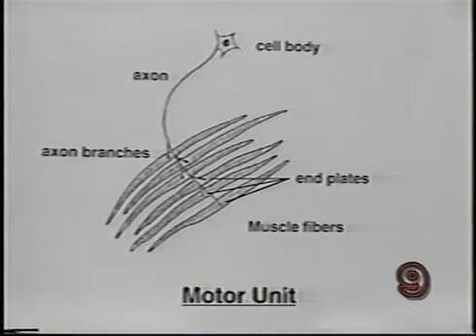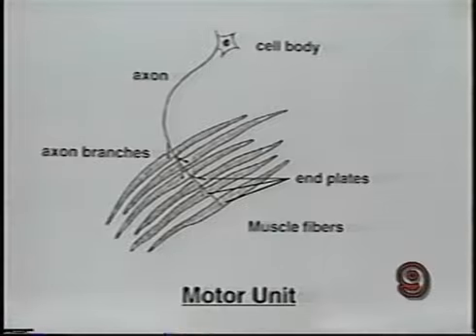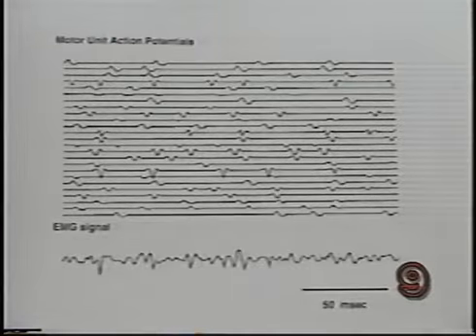When the impulse reaches the level of the neuromuscular unit, the excitation is conducted from the neuromuscular junction along the muscle fiber, and it induces the depolarization of the cell membrane and action potential. Electromyography is the recording of the action potential using extracellular electrodes.